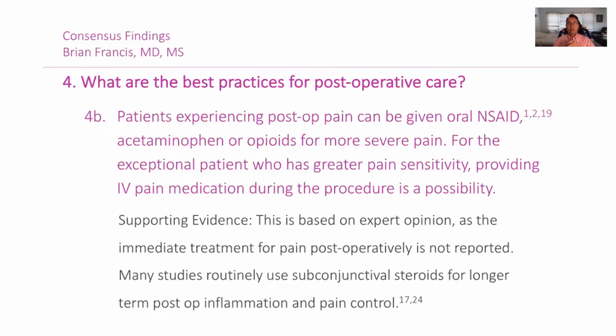I found in my practice generally, I'm doing monitored anesthesia care with IV sedation with propofol during the procedure. We typically will bring the patient to recovery and assess their pain there. It can be across the board. Patients sometimes require nothing. Some patients require oral Tylenol. Some require IV or oral Toradol, which sometimes helps quite a bit. And then for those with more severe pain, which is a minority, we can give them an opioid such as an oral pain medication, Vicodin or something of that nature, in recovery.